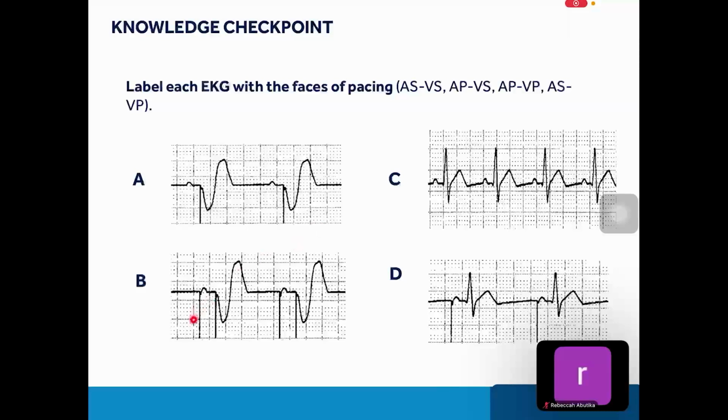P here. A pace, V pace. A pace, V pace. C. A sense, V sense. Okay. D. A pace, V sense. Okay. Very good.